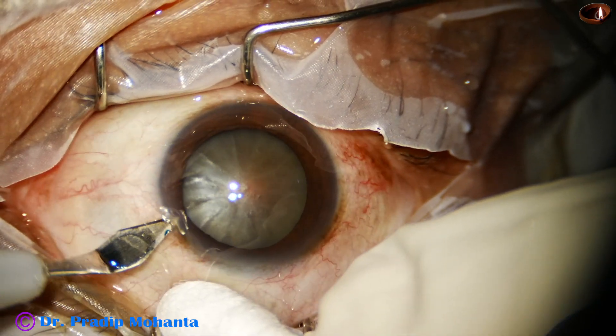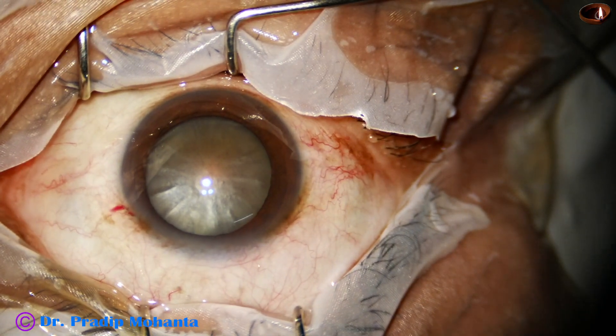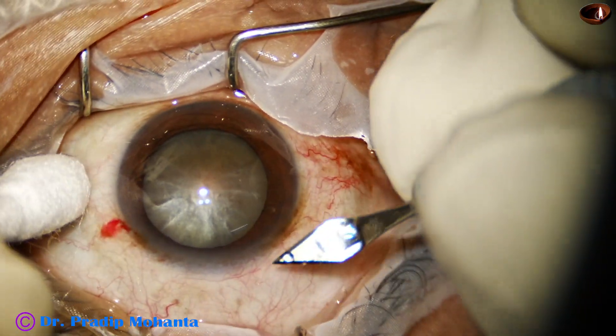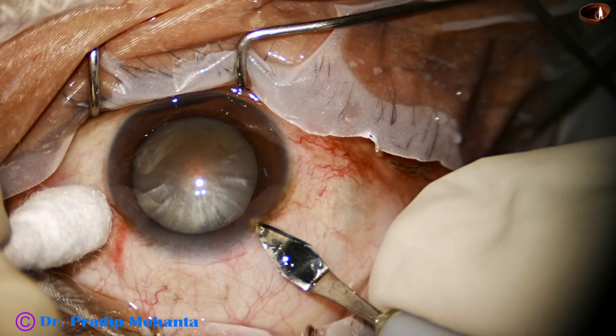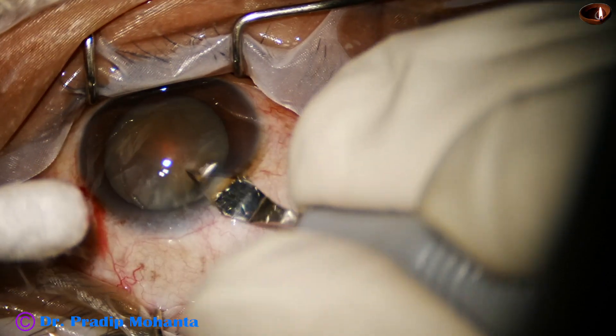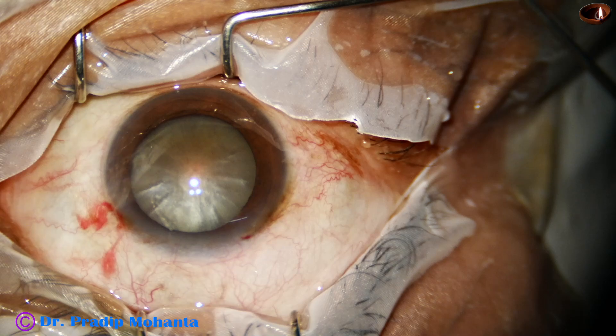First, a side port is made and then 90 degrees away from the side port, at around 11 o'clock, the main incision is done. This is a 2.8 millimeter steel keratome.